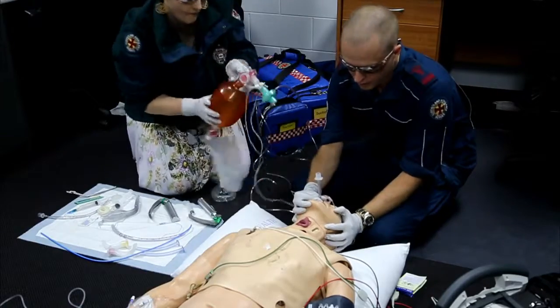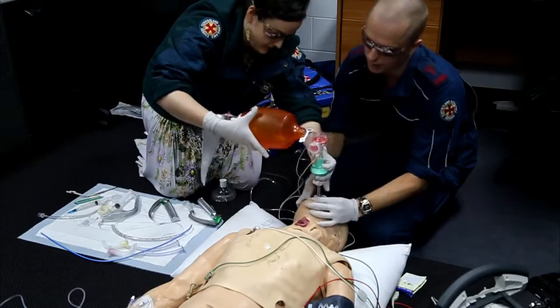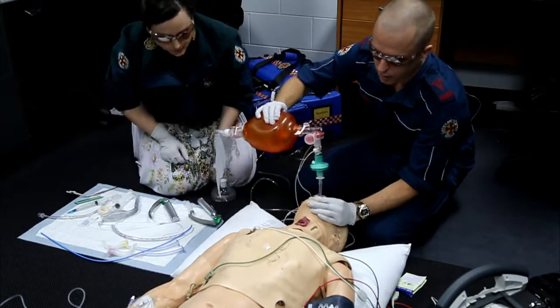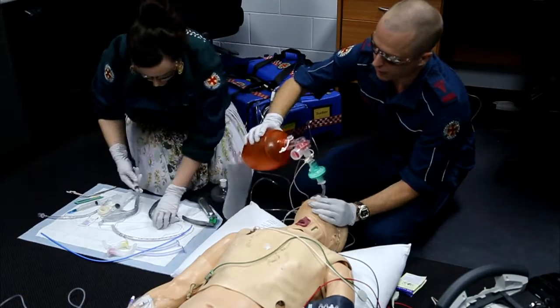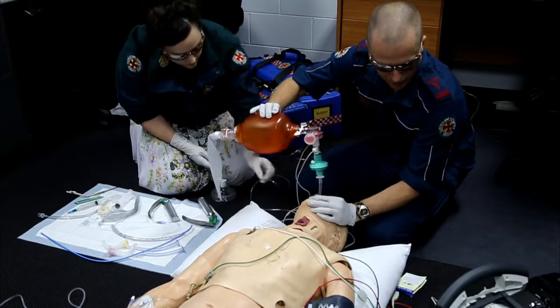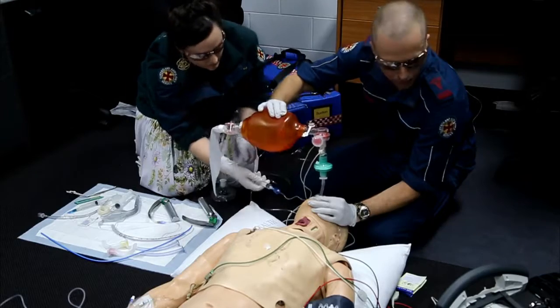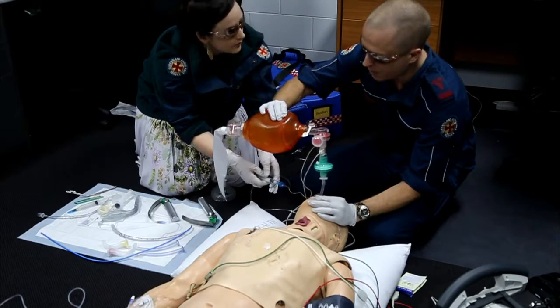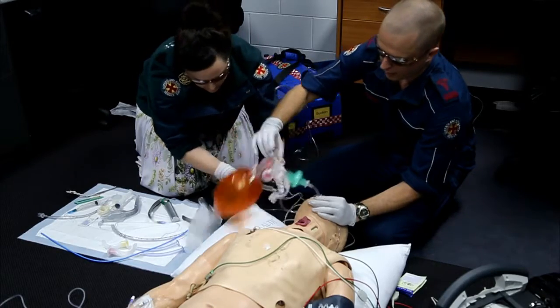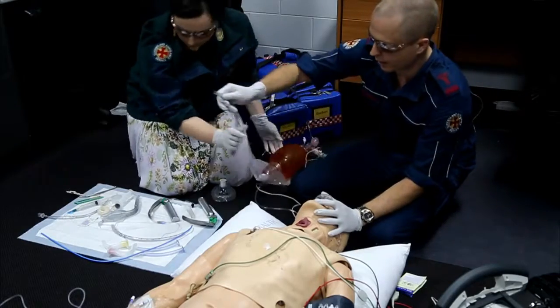Attach the bag valve mask. Okay, I've got it. Thank you. Alright, so I've got no rise and fall of the chest. It doesn't feel like the correct amount of weight on it, and the end-tidal CO2 reading is not the appropriate waveform. So this is a failed attempt, so I'm going to have to pull this, so I'll get you to deflate. Cuff deflated. Thank you. I'll detach that. Okay, get out.